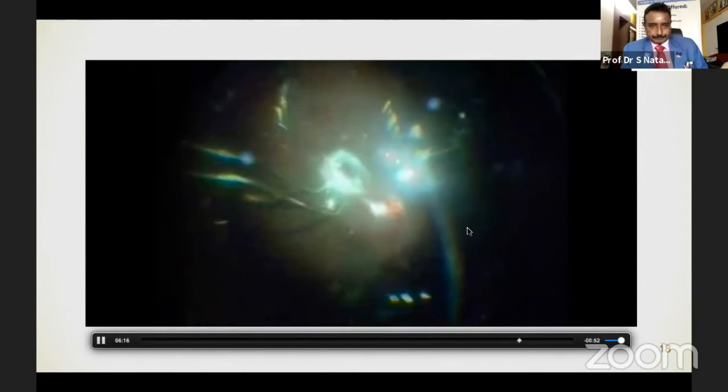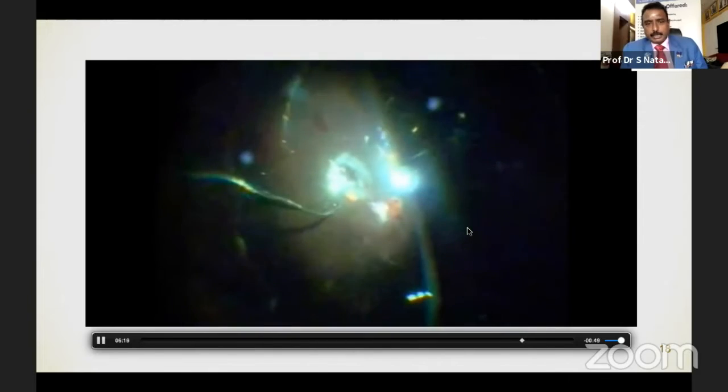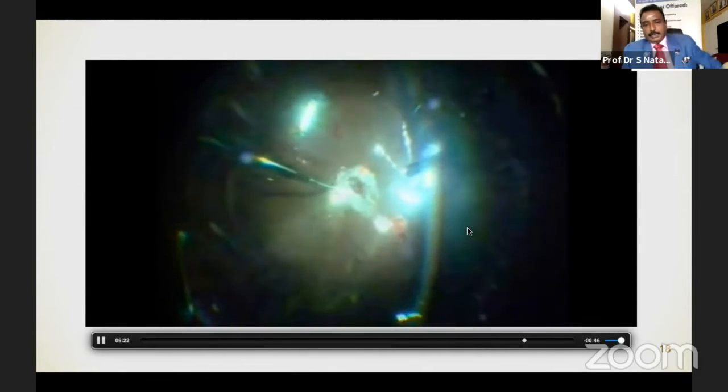And then you make sure the entire subretinal space and the periretinal area is dry, so that the entire eye is filled with air. And under air, we can do the endolaser photocoagulation. With so much traction present, I prefer to use silicone oil, and we can remove the silicone oil later once the eye is stable. And I'm using the curved probe, the endolaser, under the air. And here I'm doing the laser in the in-between retina, between the break and the optic disc.